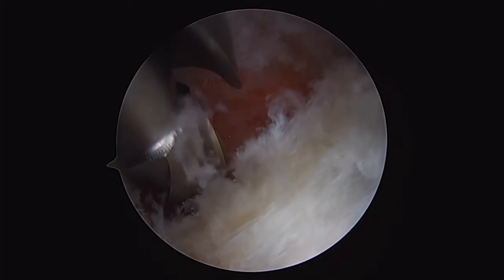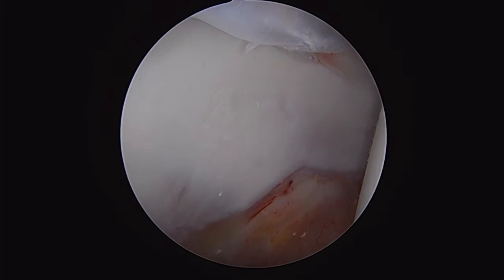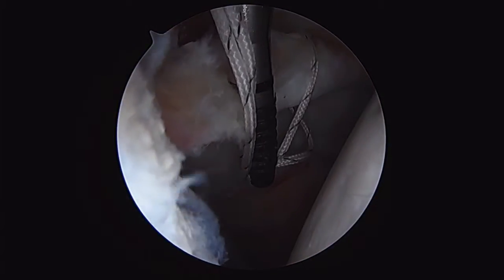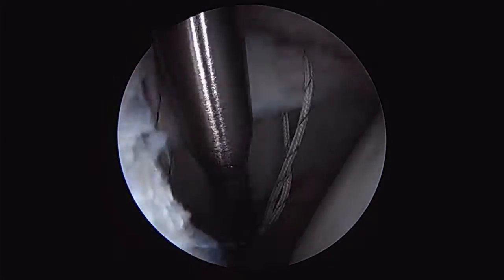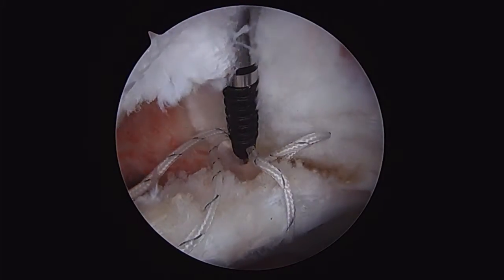Once we've got our pincer lesion resected, we'll place our sockets for our anchors. In this case, it looks like we'll need at least two anchors. You can see our labrum there. We pass the sutures around, leaving enough tail such that when we impact the anchors into their sockets, we don't over-tension the labrum up and off of the face of the acetabulum, but rather leave it where it needs to be so that it can perform a good suction seal.